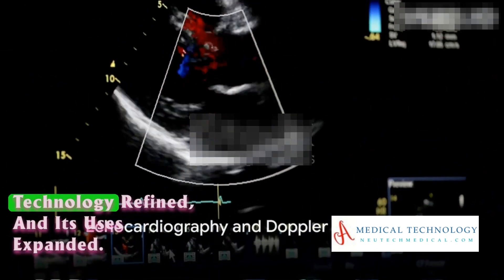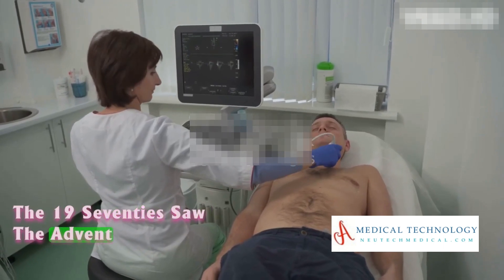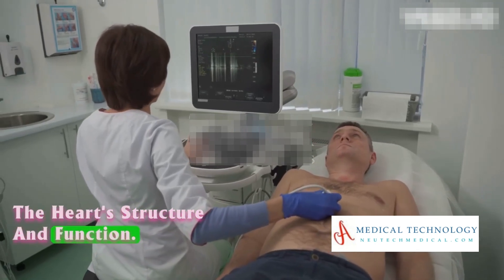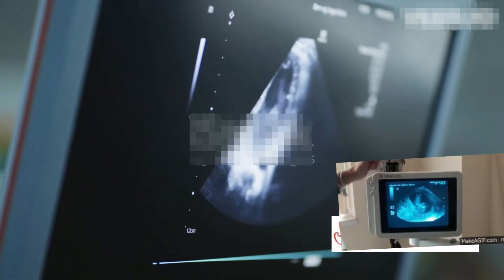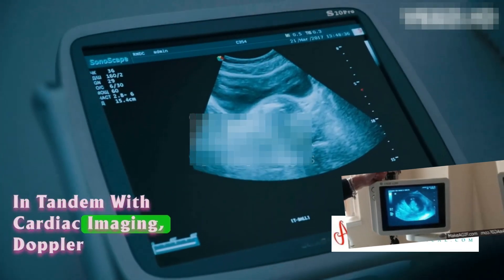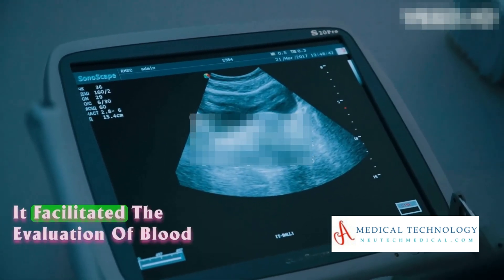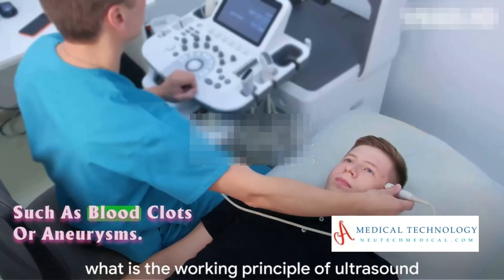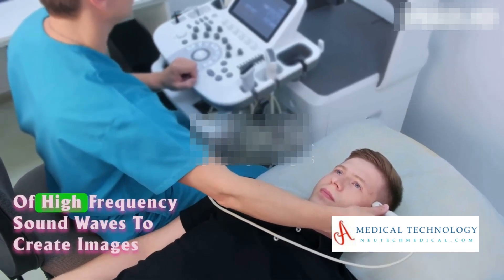As the decades rolled on, ultrasound technology refined and its uses expanded. The 1970s saw the advent of echocardiography, a groundbreaking technique for assessing heart structure and function, becoming an indispensable tool in diagnosing heart conditions. In tandem with cardiac imaging, Doppler ultrasound emerged, revolutionizing vascular imaging by facilitating the evaluation of blood flow and detection of vascular conditions such as blood clots or aneurysms.